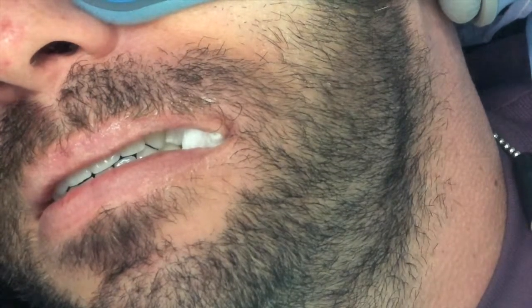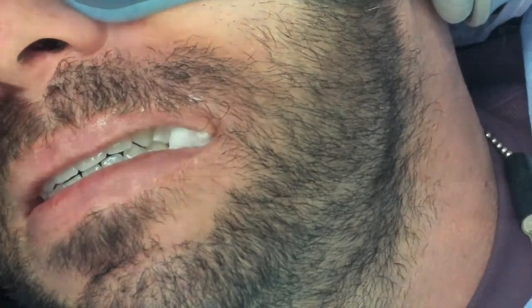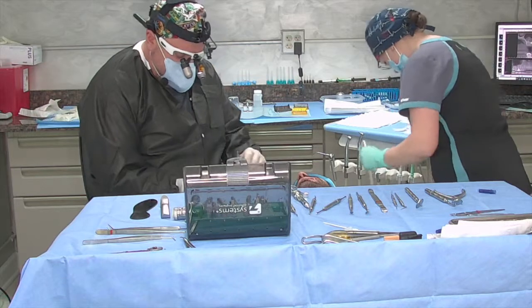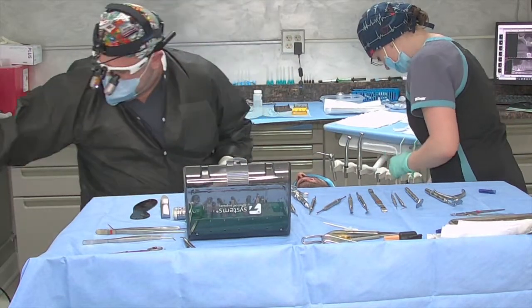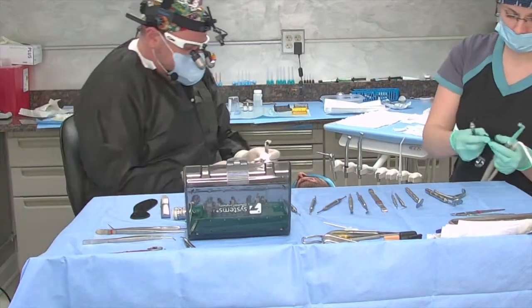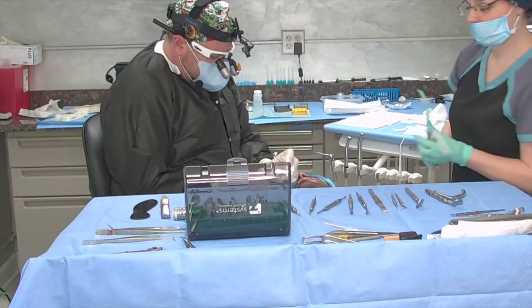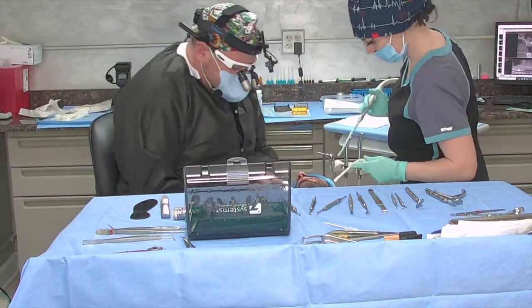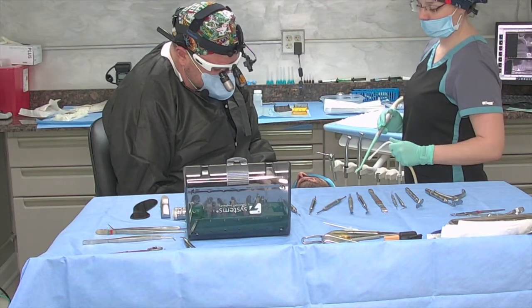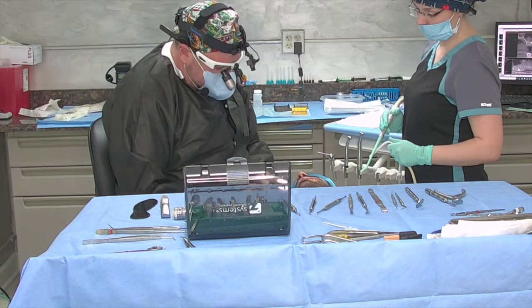All right, so let's go to our kit. I'm going to go to a drill extension for this, because I'm all the way back and I want to make sure we're getting the angle that we have. And I'm going to go, first of all, with my pilot drill. If we look here, we've got our 8, 10, and 12. We measure out at about 8 millimeters of bone, which is this first line, so I'm going to be stopping short of it. I'm going to go to about right here as far as depth is concerned, probably about 7. So I'm going to stop right about there.